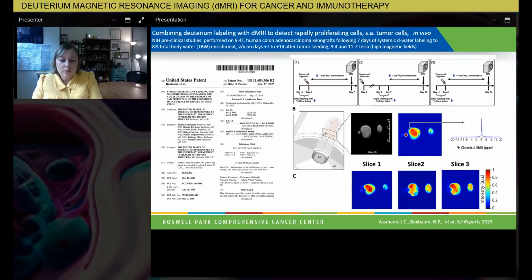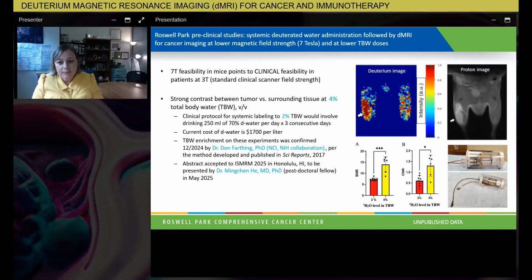So for example, if you go back to the previous slide, the tumor's pretty big, right? If we're looking at the black and white picture, that's sort of the anatomical imaging. And you can see the one layer is bigger than the other. And if you were to look at the mouse, you could see the tumor pretty well. But in other settings, let's say in a human being, you have a tumor internally in the abdomen or in the chest. You can't actually see it without doing some imaging. And sometimes when the tumor is quite small, it looks just like normal tissue. So you can't tell, is it a normal lymph node or is it one involved with lymphoma? So any kind of ability to distinguish a functionality of the tissue, like is it proliferating or is it quiescent, is very helpful in that setting.